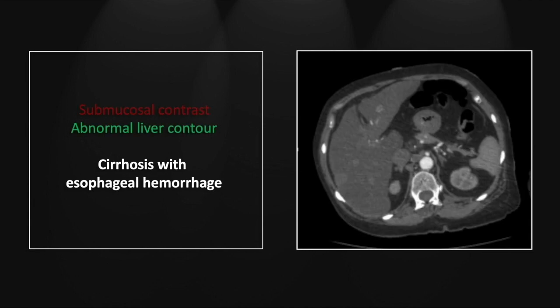In the abdomen, you can appreciate the abnormal liver contour consistent with cirrhosis, and you can see enlargement and recanalization of the umbilical vein.